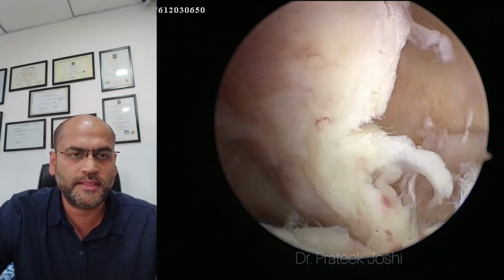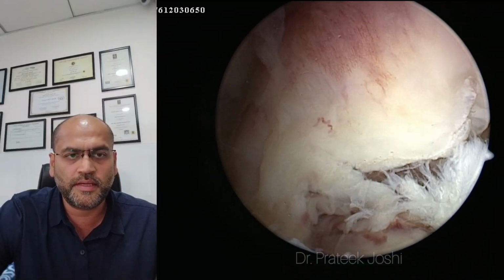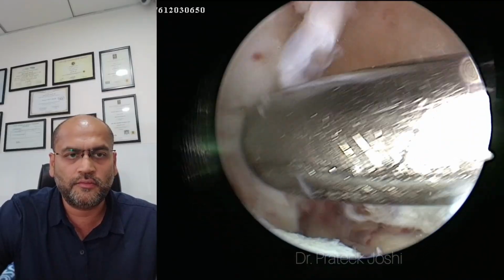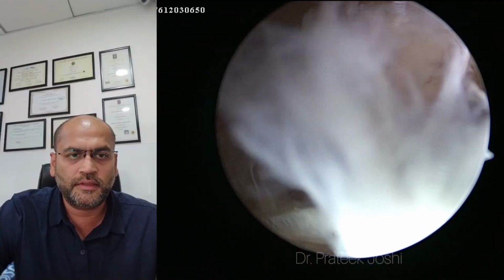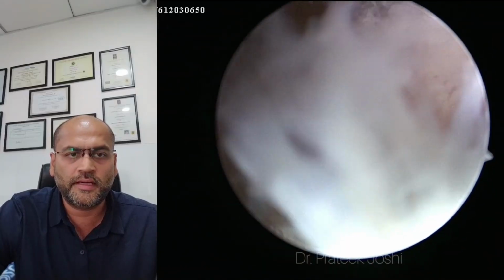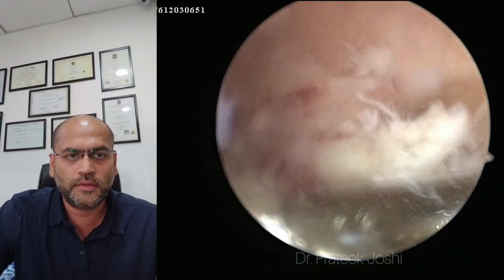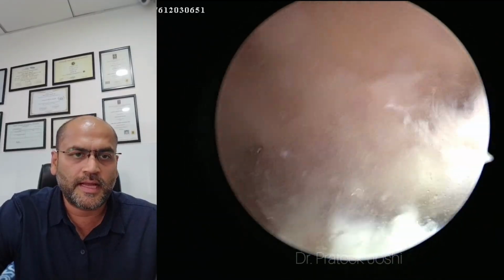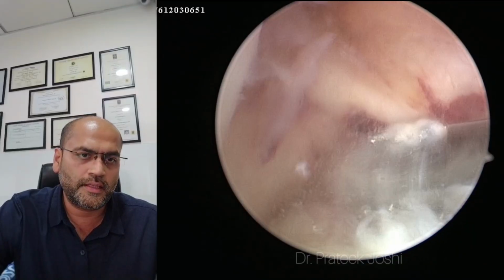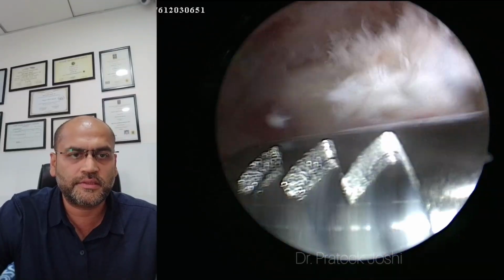As you can see, I am cutting through the ACL stump from the tibial end, and I am going to take it out with the arthroscopic grabber. So now we have a clear picture of the intercondylar notch. I am going to use an arthroscopic shaver to clean up the tibial stump of the ACL, and then I am going to create a good vision to complete the arthroscopic ACL reconstruction surgery.